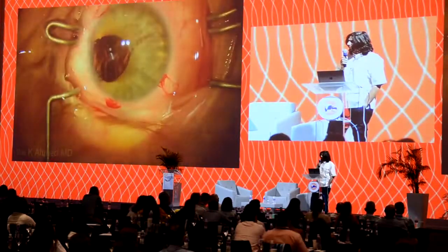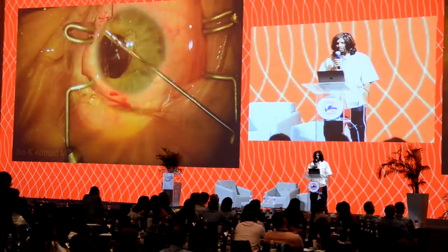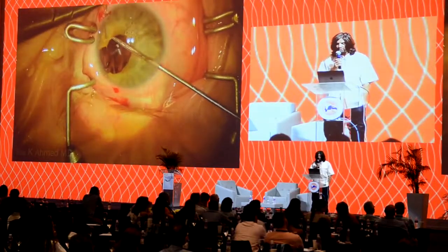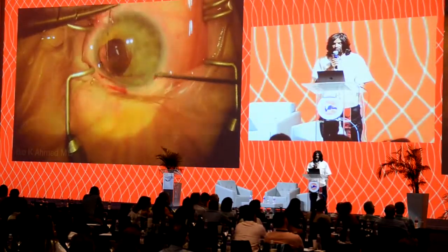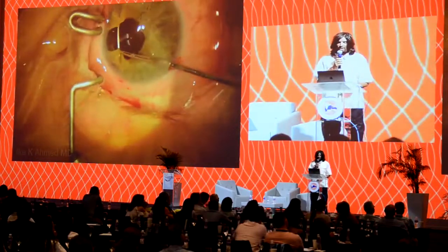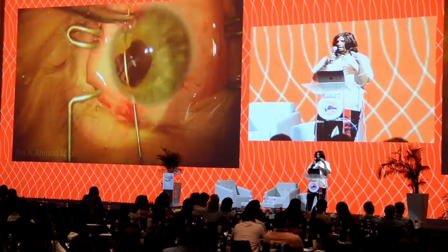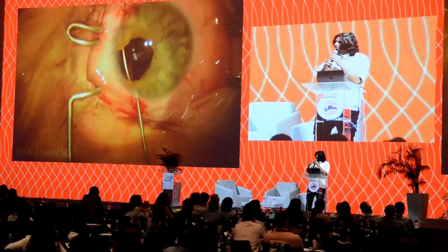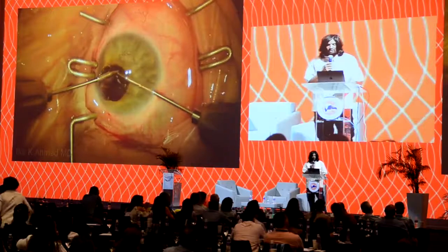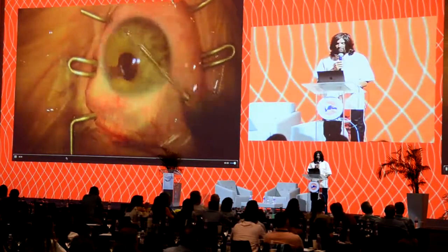This is a patient maybe that we may have chosen to do an iris prosthesis, but it's amazing how often we can manipulate the iris. This patient had previous surgery, had a large iridectomy performed many years later. The surgery was performed many years earlier, I should say. And again, we basically place our sutures out. It's helpful, again, to be able to use our left and right hand. If you're very right hand dominant, you can move the chair around or change your trajectory of your needle pass. We'll then place that suture and tie the suture there to bring the iris together.